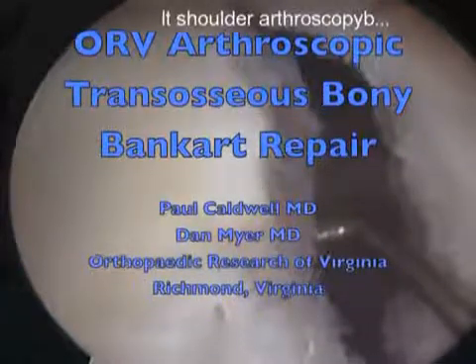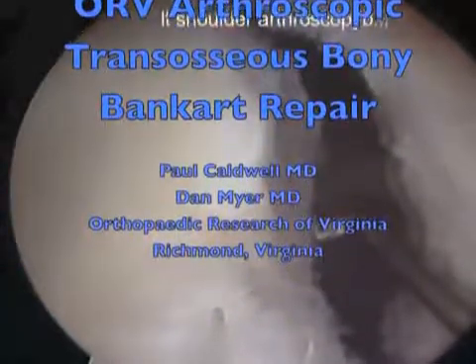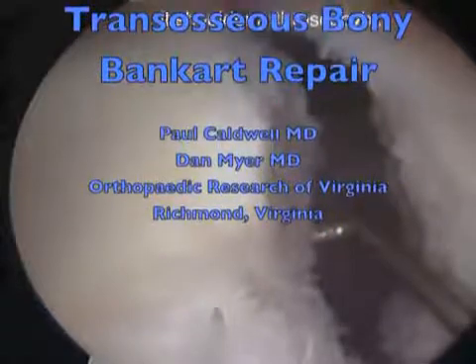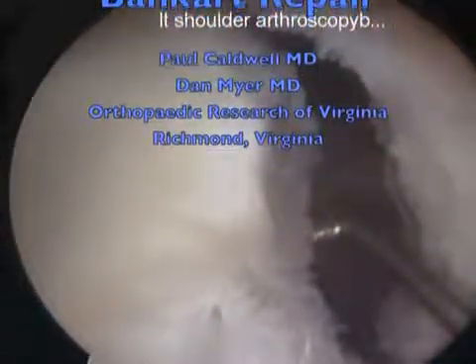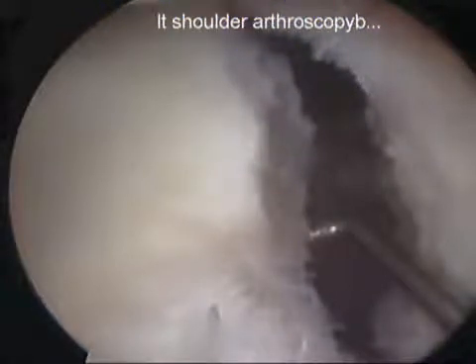the Hill-Sachs lesion. We have learned that recurrent instability is directly related to the amount of anterior bone loss, and preserving bone is imperative in repair techniques. We present our preferred technique for the management of bony Bankart lesions utilizing a transosseous repair.